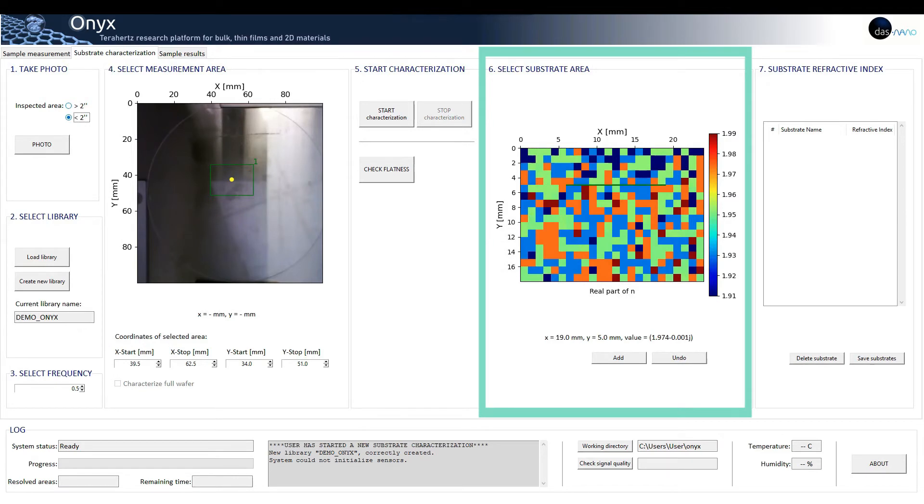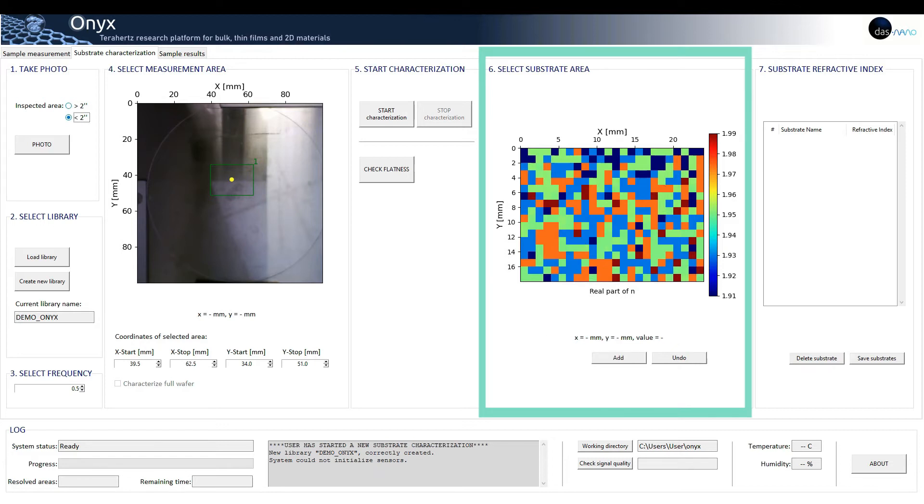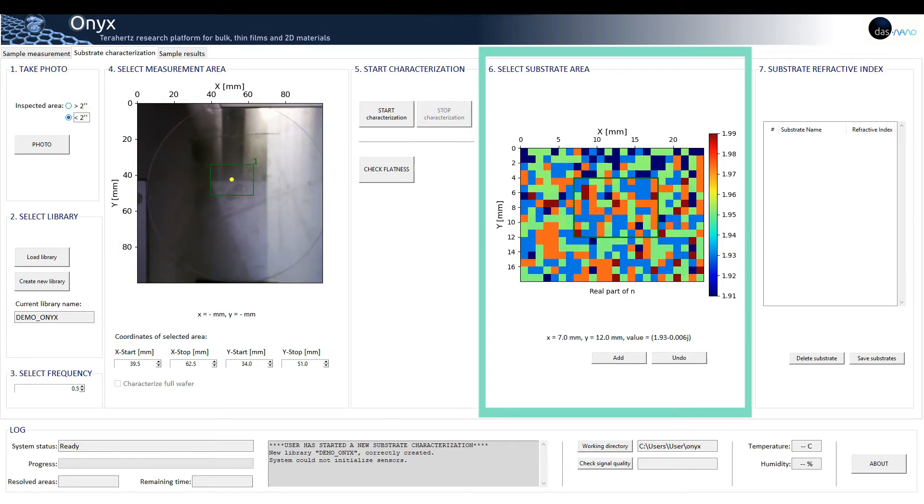In order to save the substrate refractive index to use it later, we can select the desired area and its refractive index will appear on section seven.